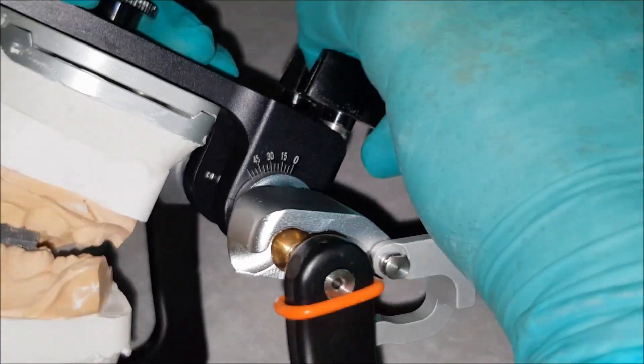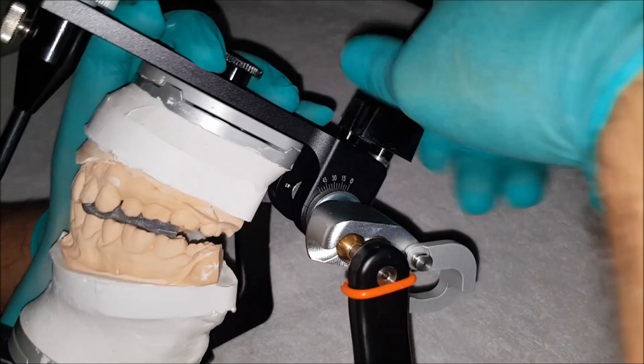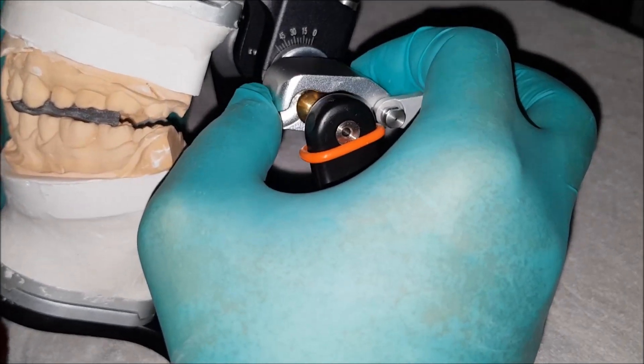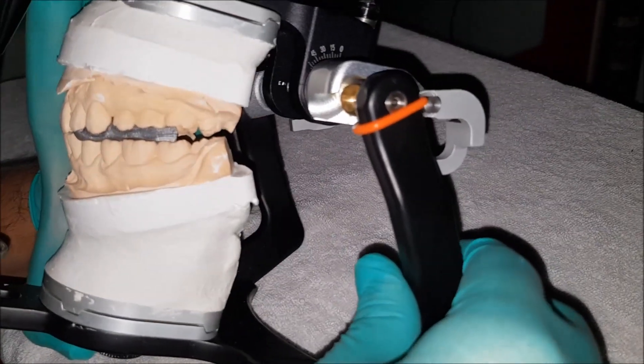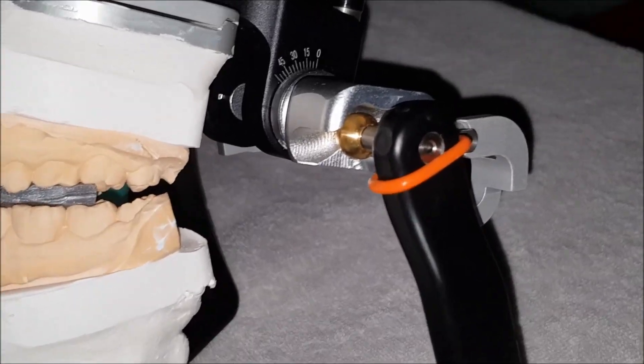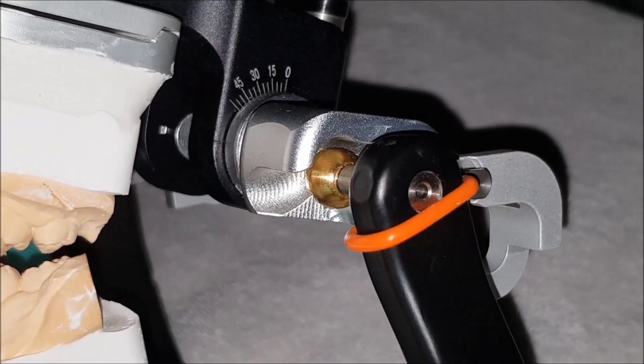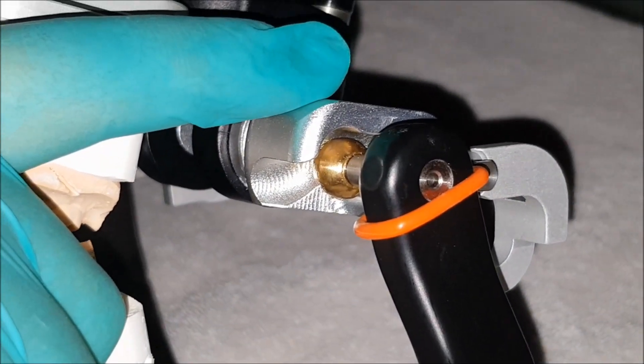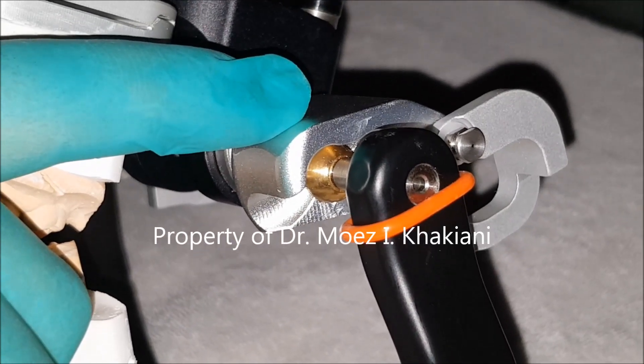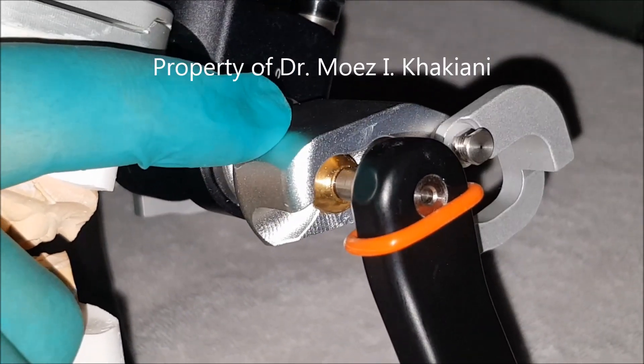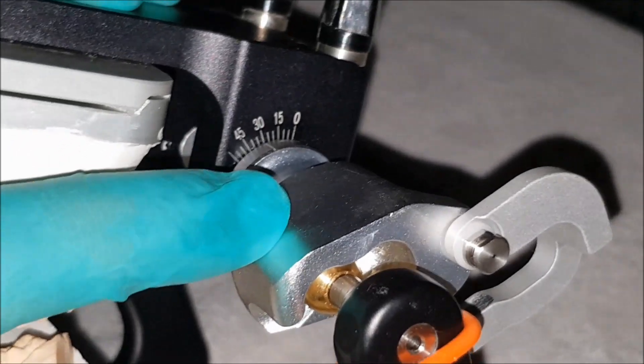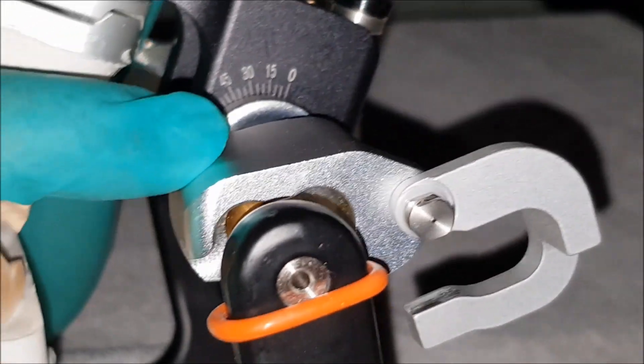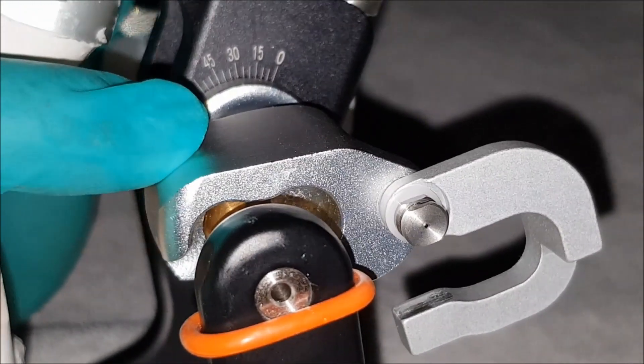Now, when I open this condylar lock, I will be able to change the condylar guidance angle of the articulator. As I open, you can appreciate I can change the angle from here. Let's zoom in and look closely. The ball is not touching the glenoid fossa at this time. However, when I put my finger here and gently push this down, at one point the ball comes and touches the fossa. The point at which the ball touches the fossa is the horizontal condylar guidance angle of the patient on that side. Here, as you can see, the H value of the patient is 30 degrees.